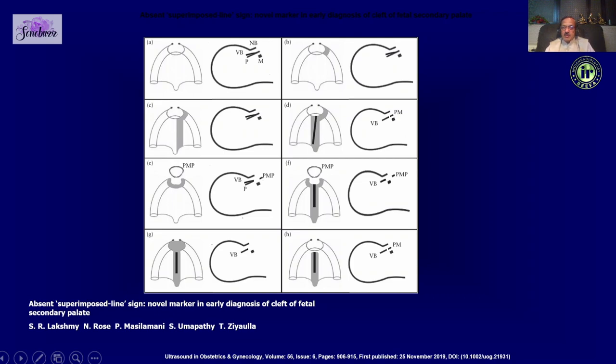When there is a cleft in the palate, you see only the vomer bone — this is labeled as absence of the superimposed line sign. She has two or three articles in both the ISUOG journal and the AIUM journal which I urge you to read.